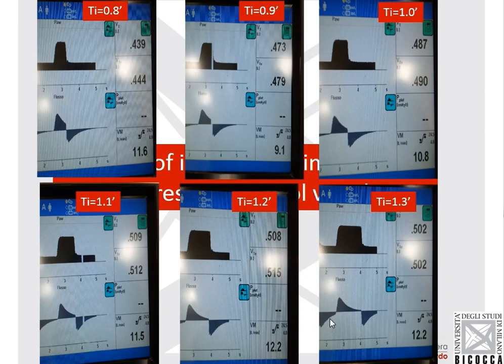As you see here, we still have some expiratory flow. At the end of expiration, we are trapping some gas in the alveoli, and so we are generating intrinsic PEEP, and this will cause a drop in tidal volume. So it's a little bit complex, and again, I'm going a little bit fast, but just to remind you that when you're working in pressure control ventilation, there are many factors that can affect your minute ventilation.